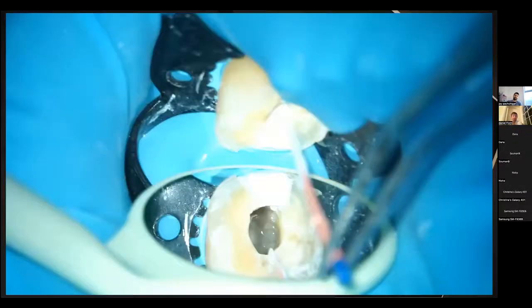No, absolutely. I think that's a really good point, and it's so rare that people actually mention that, because we see it lots of times in surgery as well, where you look at the radiograph and it looks fantastic. But then when you actually do the surgery, there's just GP with no sealer around it at the top, with loads of leakage all around it. So it's a lot more challenging than people realize to get the actual sealer to length.